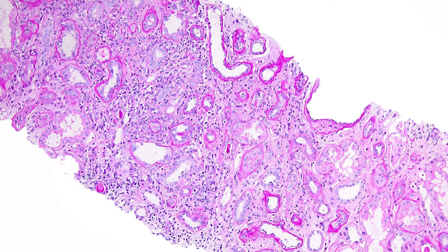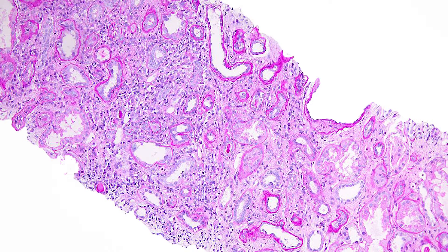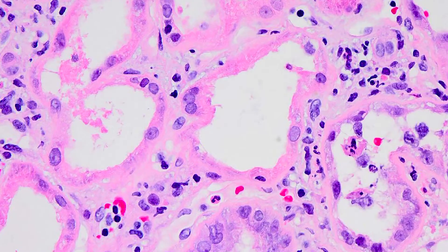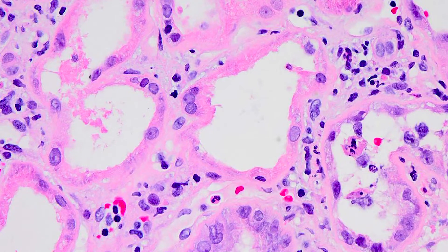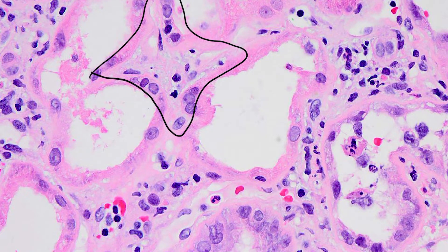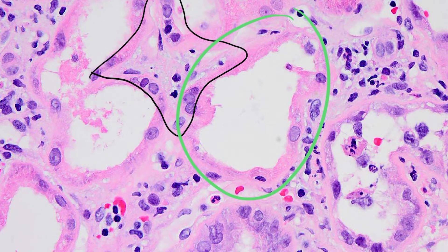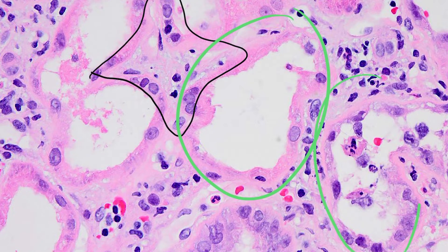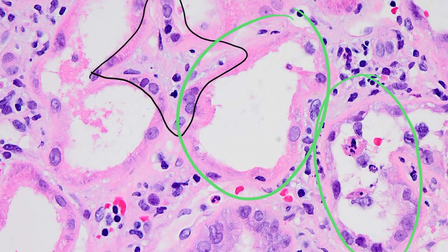As you can see at this medium-power PAS stain section, we have obvious predominant lymphoplasmacytic inflammation along with areas of tubular atrophy. And if we go down to a higher magnification on this H&E stain section, we see interstitial edema with inflammation, and then looking at the tubules, we have significant acute tubular injury characterized by severe epithelial simplification and reactive nuclear changes as well as epithelial sloughing with associated apoptotic debris.